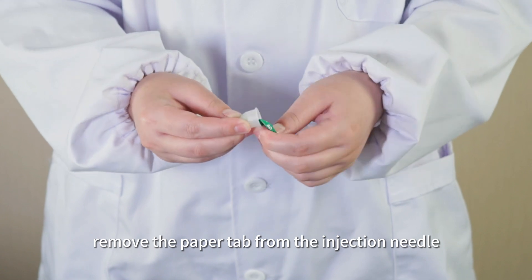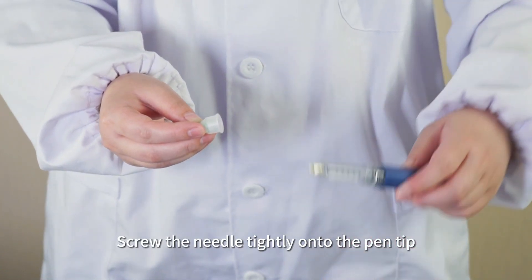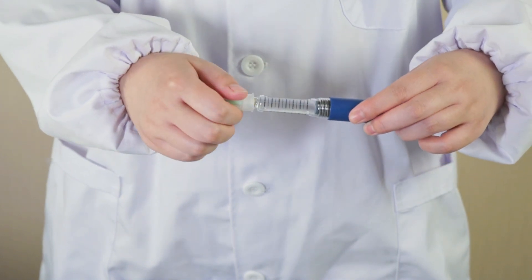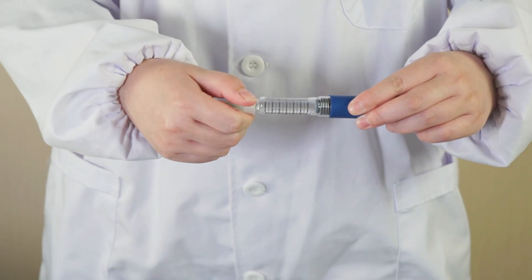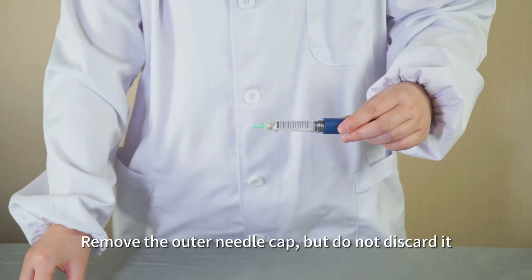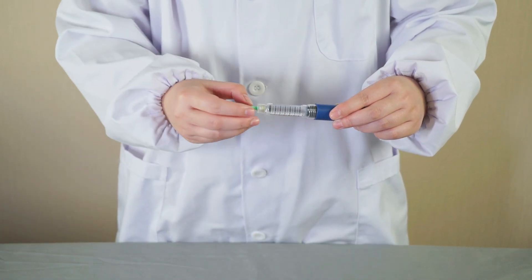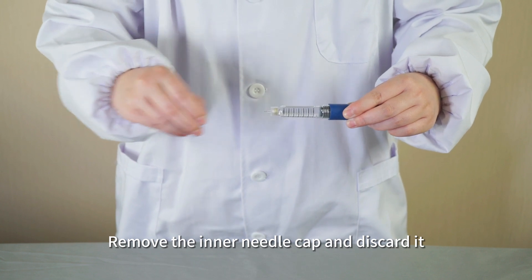Before each injection, remove the paper tab from the injection needle and screw the needle tightly onto the pen tip. Remove the outer needle cap, but do not discard it — keep it for later when removing the needle. Remove the inner needle cap and discard it.